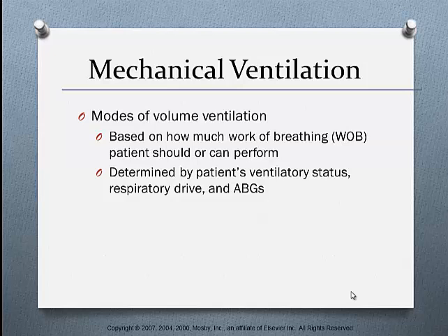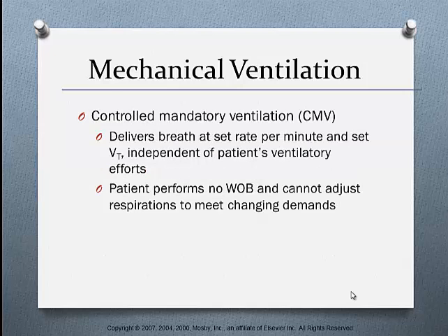they're hypoventilating. We have controlled mandatory ventilation. This is when it delivers a breath at a set rate per minute and a set tidal volume. This is independent of the patient's ventilatory efforts. In this case, the ventilator is doing all of the work, and the patient performs no work of breathing and cannot adjust respirations to meet the changing demands.